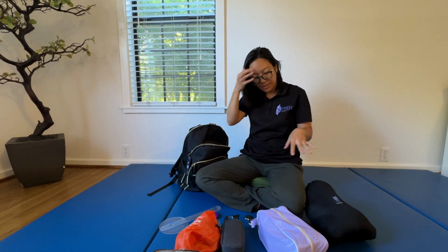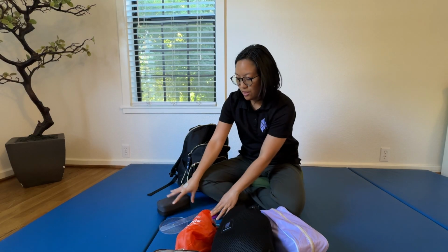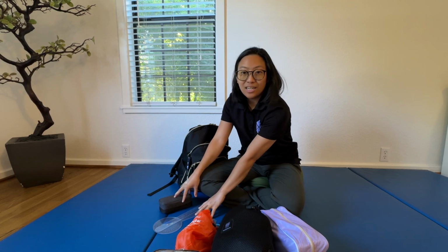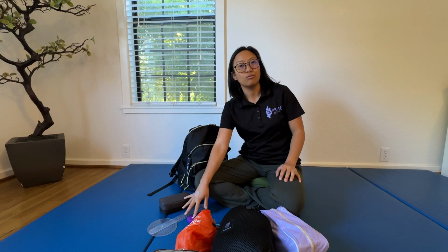So you can simplify it to, I have my more evaluation type stuff that I get my measurements updated on. I do have a dynamometer that I will use as well if I'm wanting to be a little bit more specific with muscle tests for gross MMT or for hand grip dynamometry. I have that as well. That I usually only use at evaluation day, but these I tend to reuse and revisit every single time that I'm in session with someone.